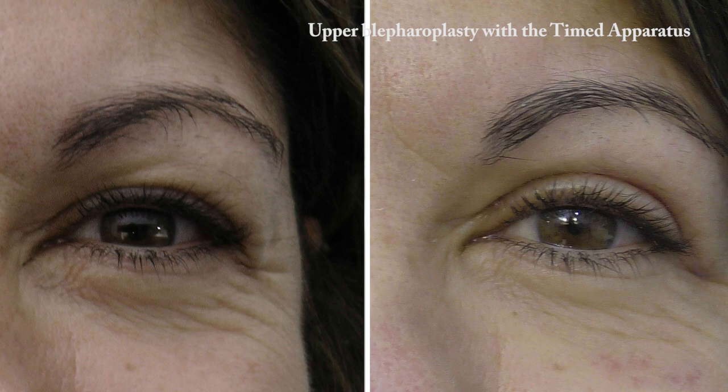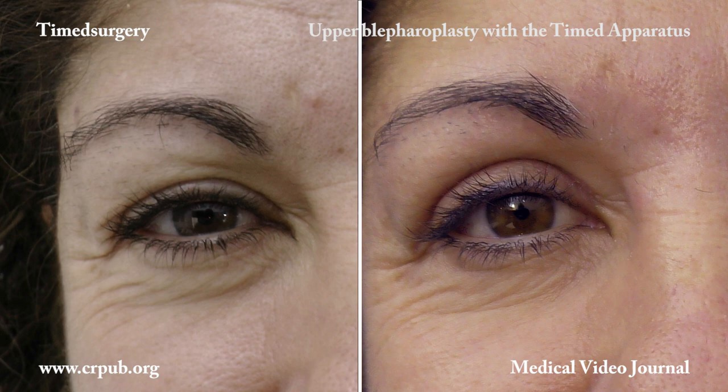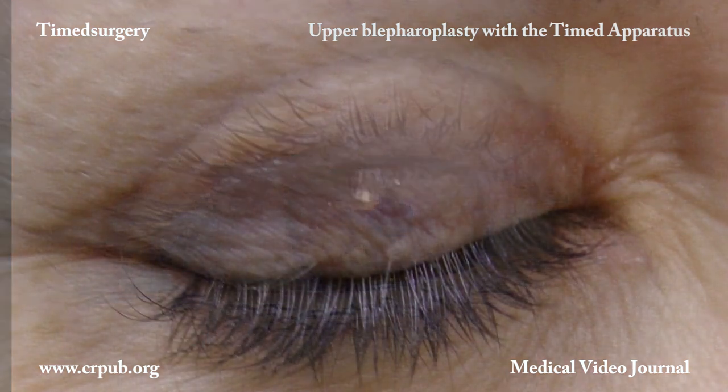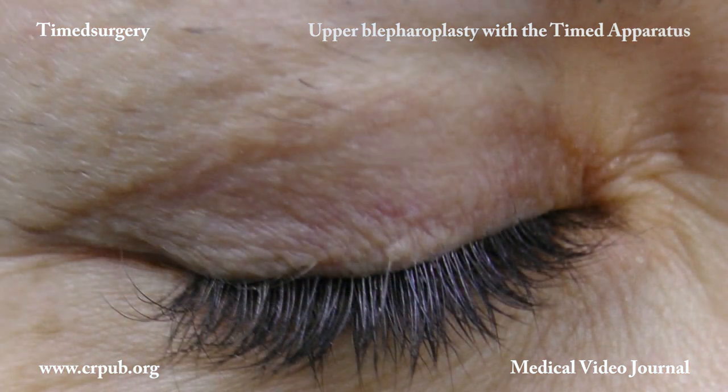Surgical blepharoplasty in small orbits yields a natural result. The eye looks bigger and the palpable fold appears fuller and younger. The skin scar left by rapid pulsed timed surgical cutting is excellent — it is never hypertrophic, practically invisible, and of superior quality to that of any other type of cutting.